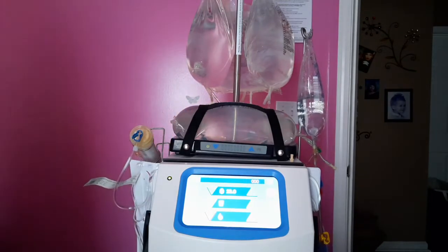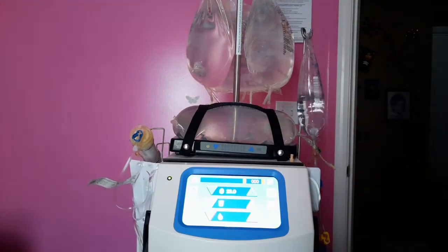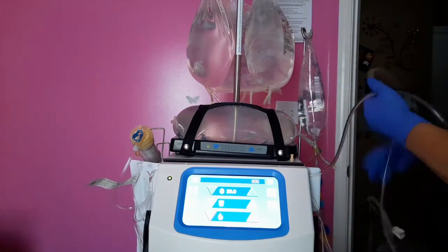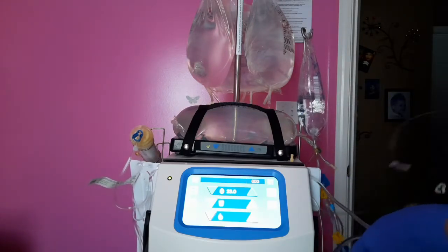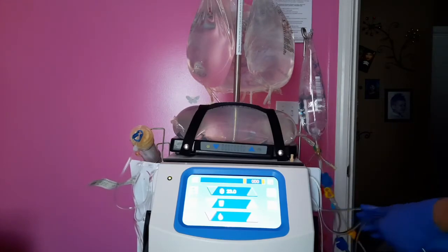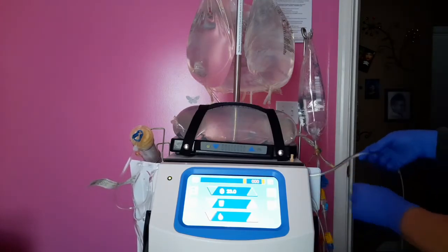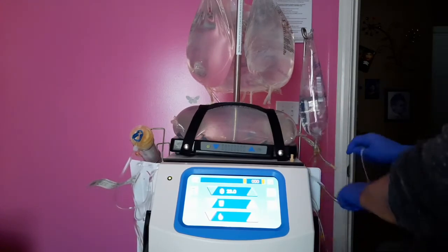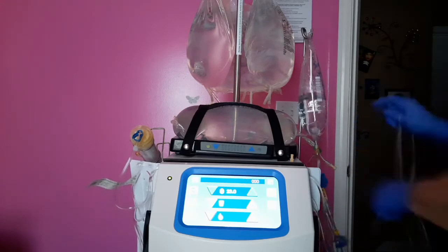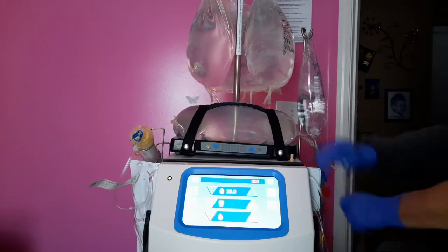And we're going to move on now to the venous. So essentially what we're doing is we're going around the cycler, okay? That's good. That's how the blood travels. Okay, so now we've got our venous. The venous is the very top line. Okay, hold on. Let me untangle this before I start. The venous is the top line that comes out from the top of the cartridge on the right. So again, L shape, the other way, like this. Because you're going up from the cartridge and up to the saline bag. And this is called snapping. So we're snapping the line up to the saline.